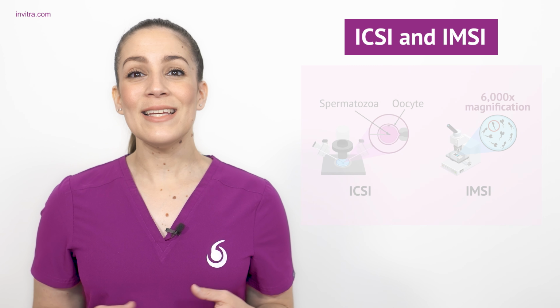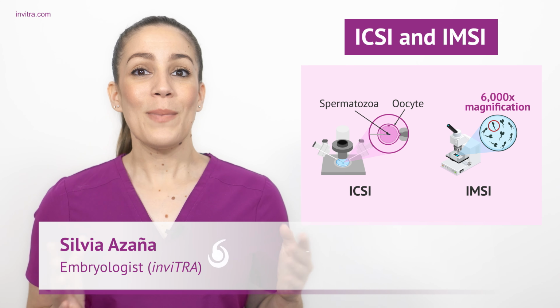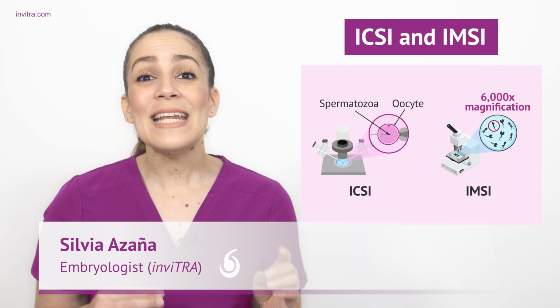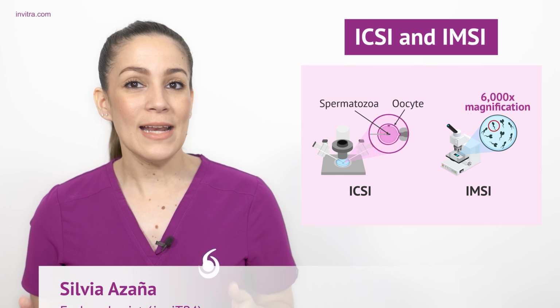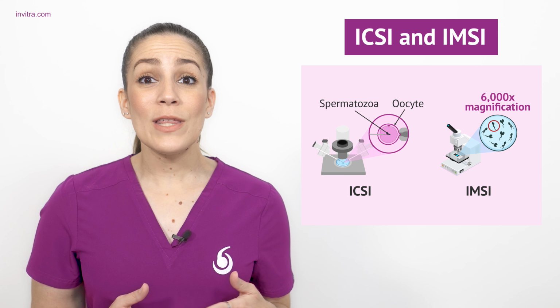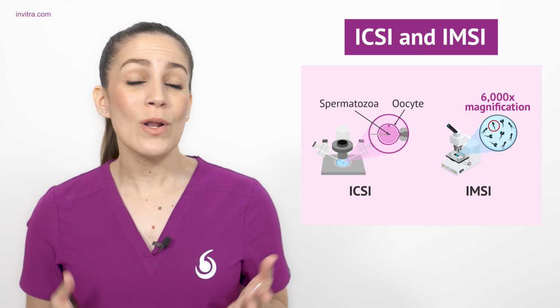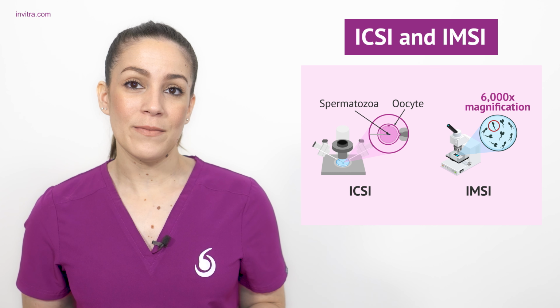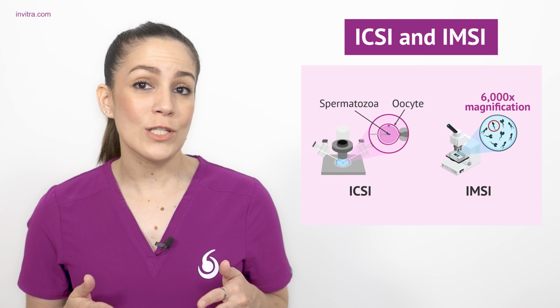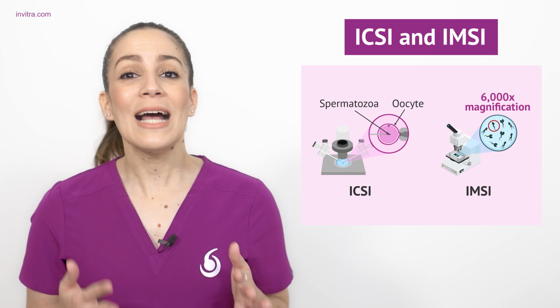Intracytoplasmic sperm injection, or ICSI, is a widely used assisted reproduction technique. To perform this procedure, the embryologist introduces a spermatozoon directly into the egg in the laboratory with the help of a microinjector. In this case, the sperm that is microinjected is selected at a magnification of 400 times based on its motility and morphology. Nevertheless, a morphological evaluation of the spermatozoa can be conducted at a high magnification exceeding 6,000 times prior to the ICSI procedure.